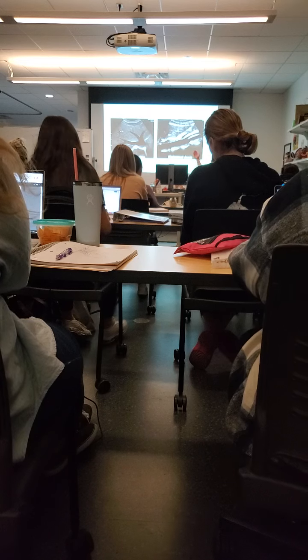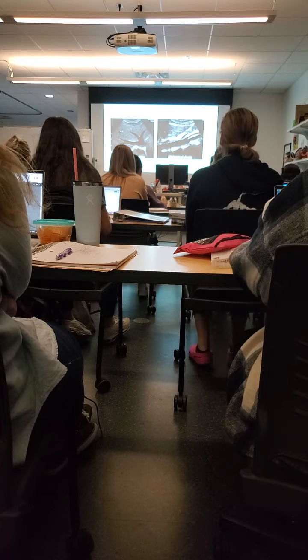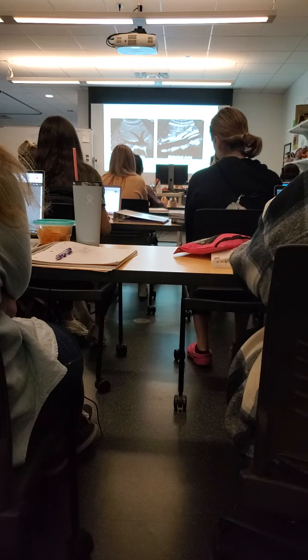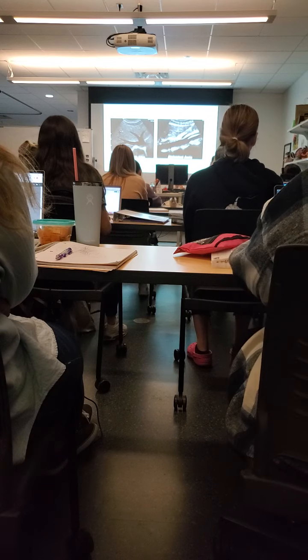Let's do this one. The first one is this. This is the hepatic veins. You see there's a left, there's a right, and a mid. And is this transverse or sag? Transverse. You got it.